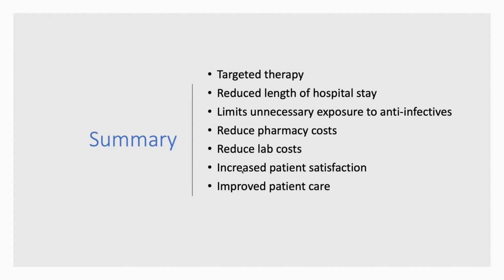It definitely made an impact on pharmacy costs because we weren't doing vancomycin trough levels, we weren't giving him vancomycin, we weren't giving him ceftriaxone. It reduced lab costs because we didn't send off for 4 or 5 different tests. We didn't send it to a reference lab.